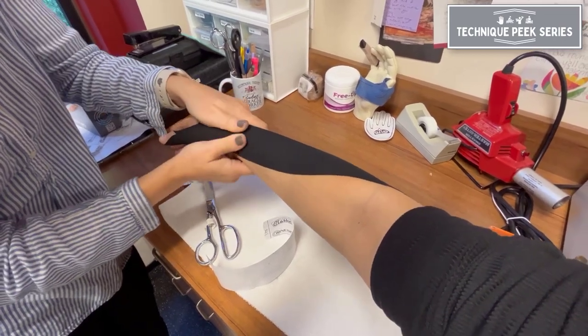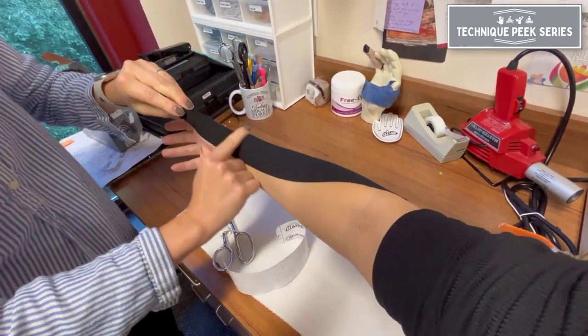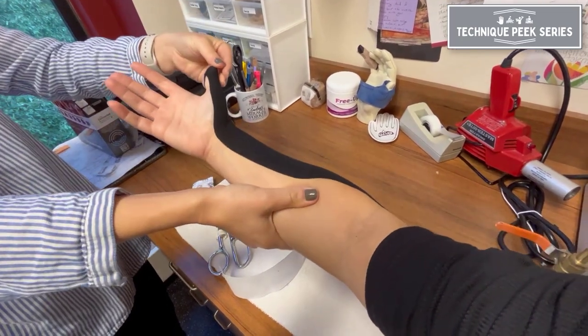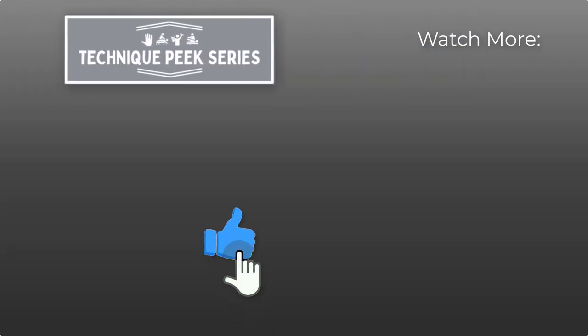In review, the completed application of the kinesio tape strip going from proximal to distal will provide facilitation to the extensor pollicis longus muscle. To inhibit the muscle, you would tape in the opposite direction from distal to proximal.